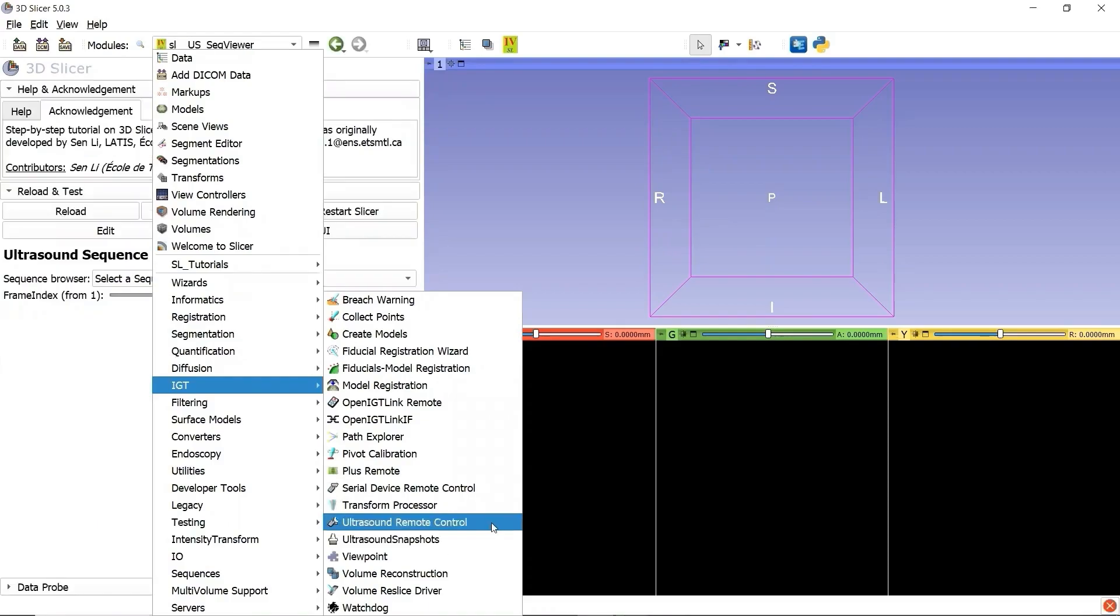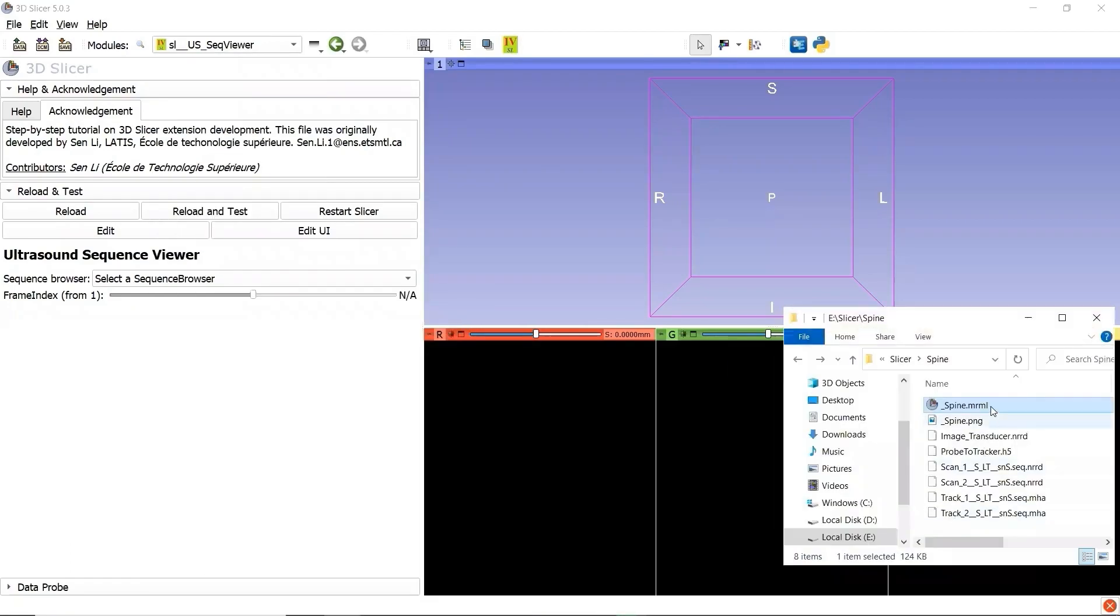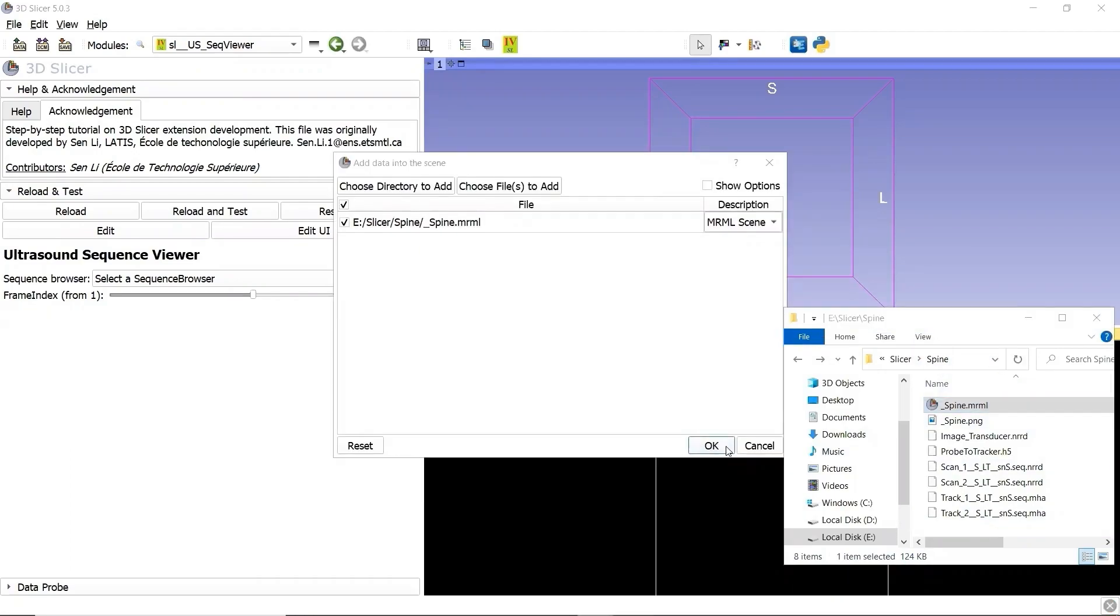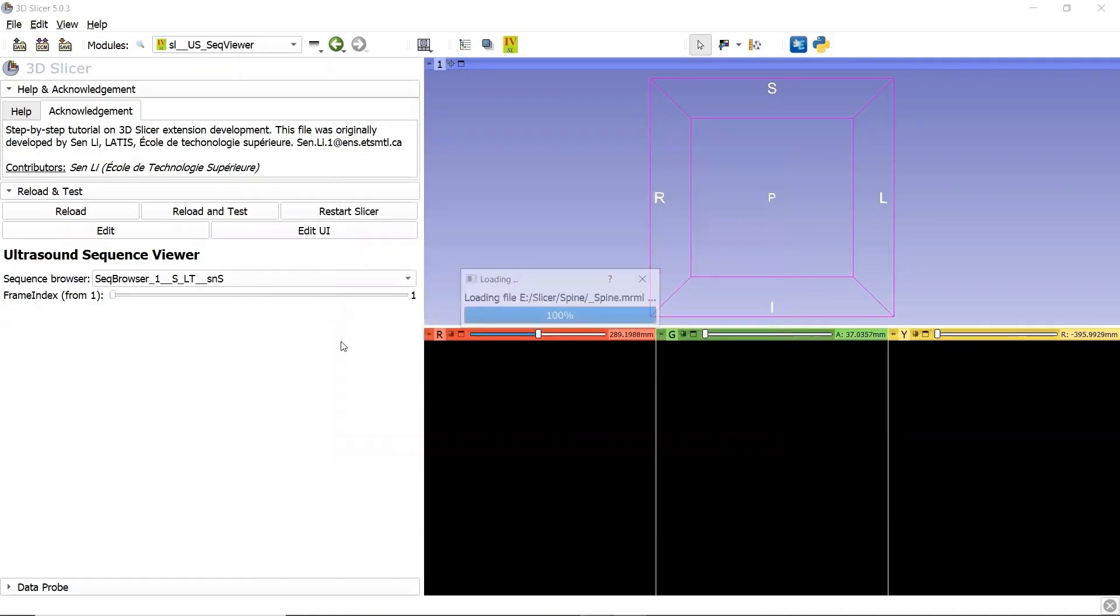Let's load an ultrasound sequence file. We go to our sequence viewer module, open our sequence file folder, and drag the sequence file to 3D Slicer. Click OK, and now we can view the ultrasound sequence images.